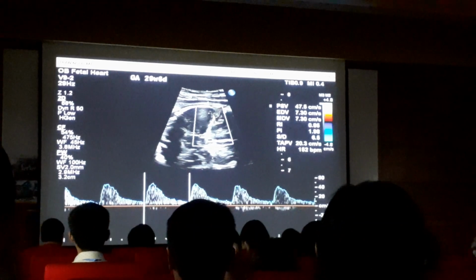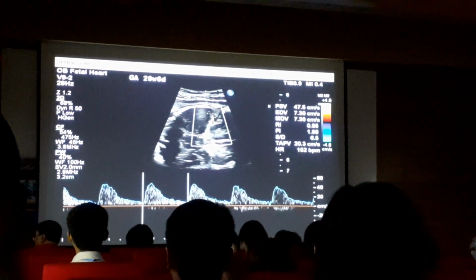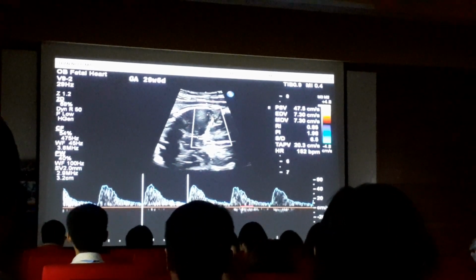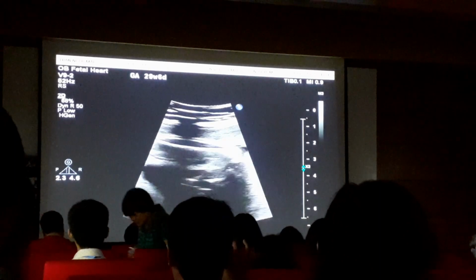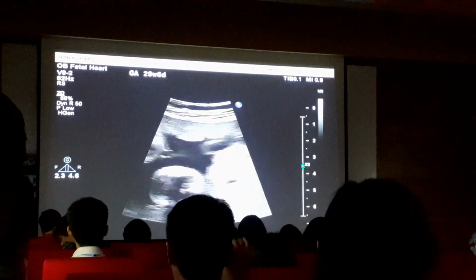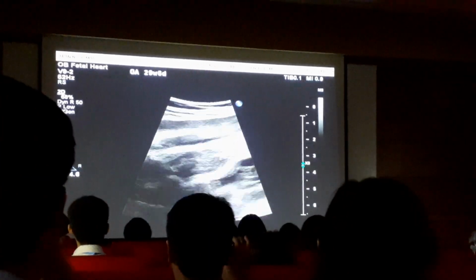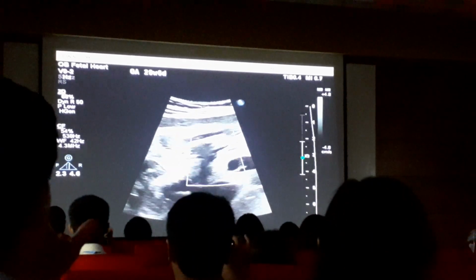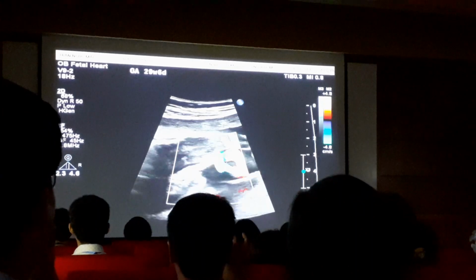Cái này các bạn muốn coi cho kỹ càng phải có cái website, cái trang web của mình coi theo tuần thai, nhưng mà ở đây thầy cô nói cái này là bình thường. And high resistance. Có cái kháng lực cũng hơi cao. So not anemia, already ruled out. Không có thiếu máu. The next thing that I would look at is the bladder. Cái coi cái bàng quang.